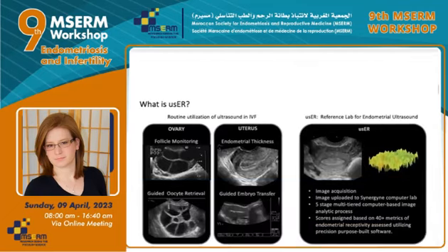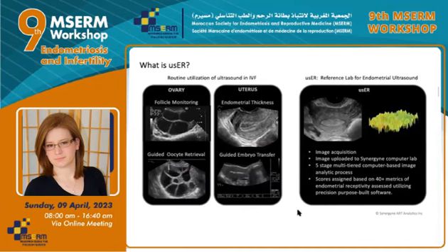So as I was saying earlier, ultrasound has become a fundamental part of assisted reproductive therapies. Clinics are often accustomed to using ultrasound for follicle monitoring, guided oocyte retrieval, taking endometrial thickness and pattern assessments, and guiding the embryo transfer. And it does all of these things incredibly well. With this high utility, it can be easy to think of these fundamental procedures as the limits of the technology. But these tasks are truly not the limits.